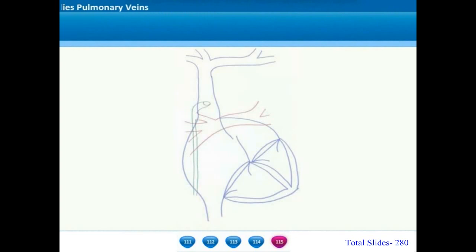the pulmonary veins form a confluence. The common chamber connects to the azygos vein through a communicating vein, and the azygos subsequently enters into the right superior vena cava. Since the azygos is not a very huge structure, it always produces some obstruction to the flow of pulmonary venous blood. Most of the azygos type of TAPVCs are obstructed.